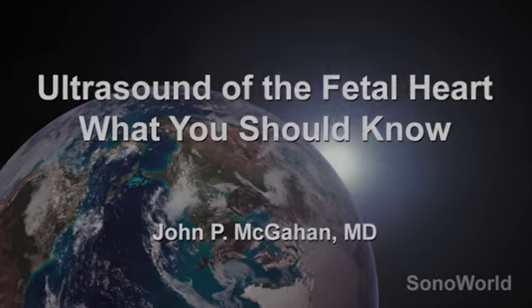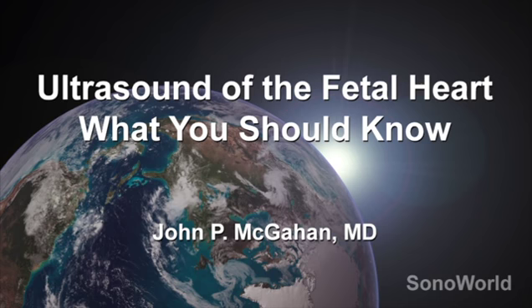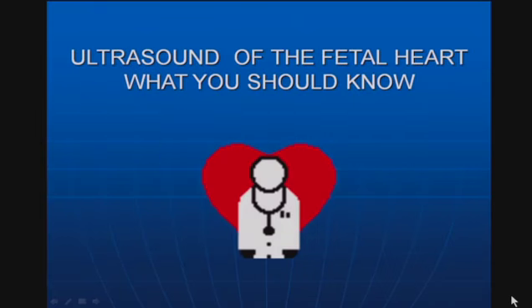I'm going to talk to you about the topic of what everybody should know about examination of the fetal heart today. What I'm going to talk about is ultrasound of the fetal heart, what everyone should know.